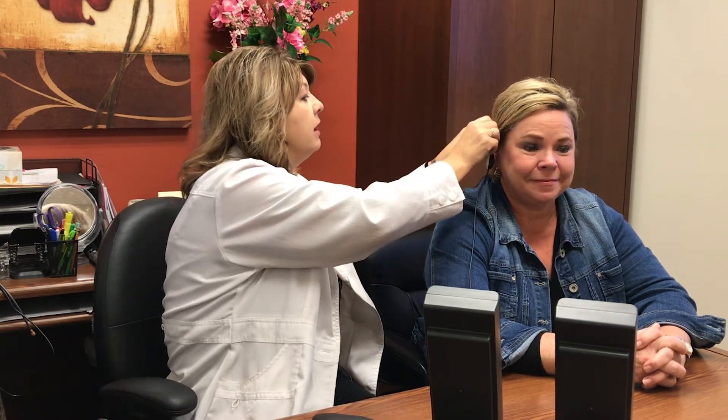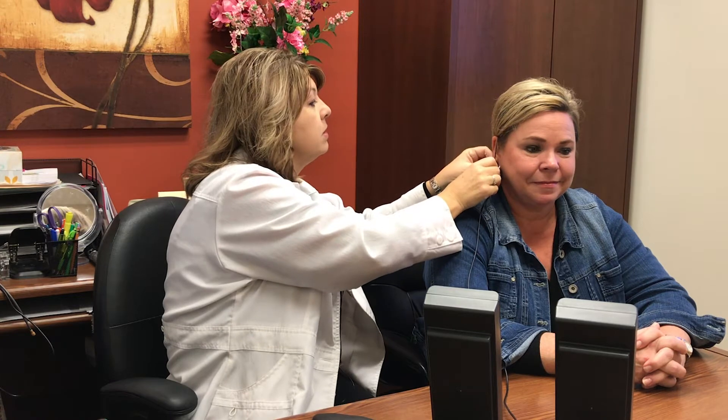The first thing we're going to do is hang a little probe tip microphone over the ear, and then we are going to calibrate our speakers — for this you don't have to do a thing. You're going to hear some static that comes out of the speakers. It's pretty quick.